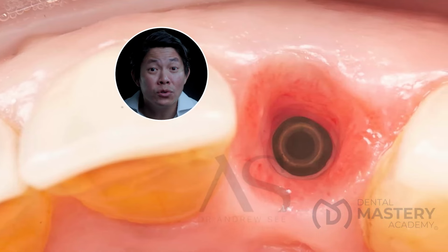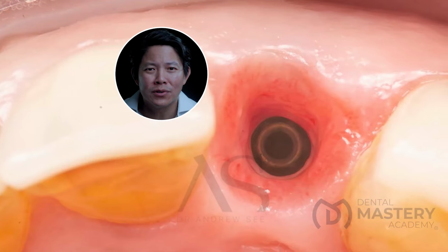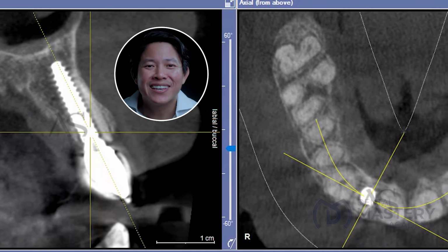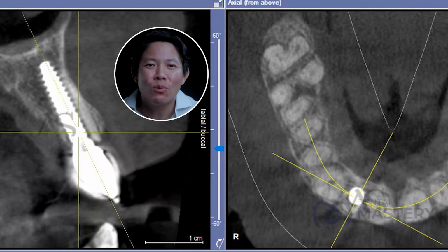If we have a look at the occlusal view, we can see that there is zero bone loss of the buccal bone. There is no concavity present. Why? It's because the body thinks that the tooth is still there, and because of that, it does not eat away our buccal bone.